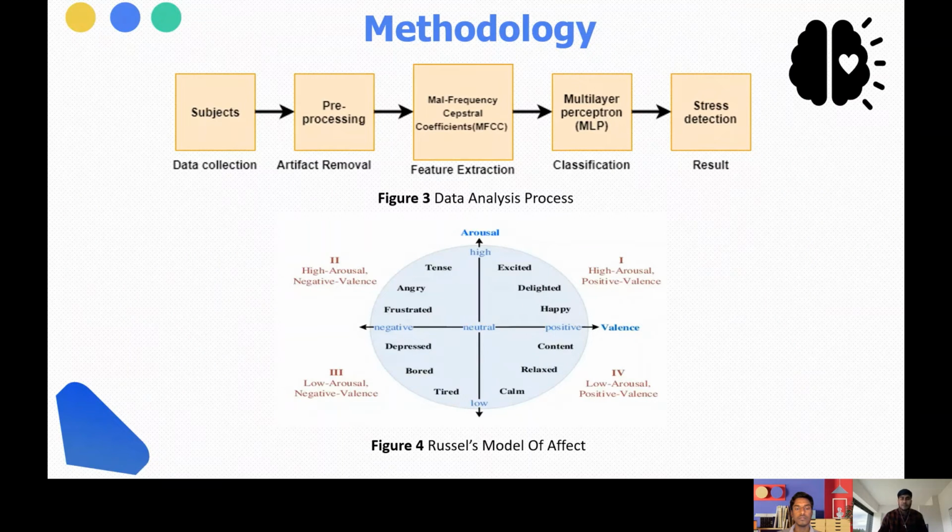Training is required by matching up the values of valence and arousal with the respective type of emotion by the Russell model of affect. The result of the test is classified by observing the plotted valence-arousal graph. Here is the Russell model of affect.